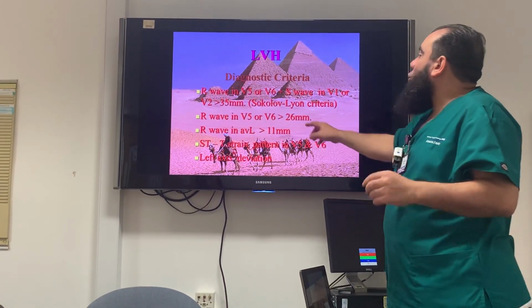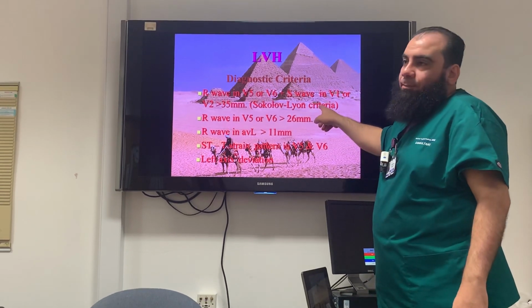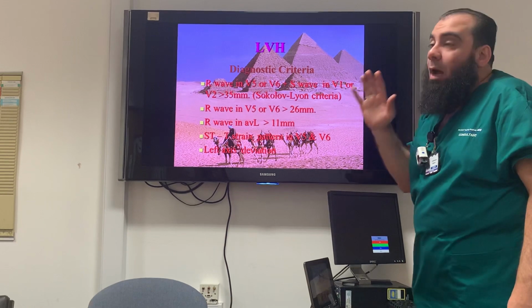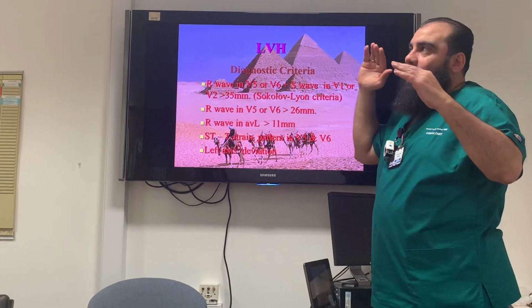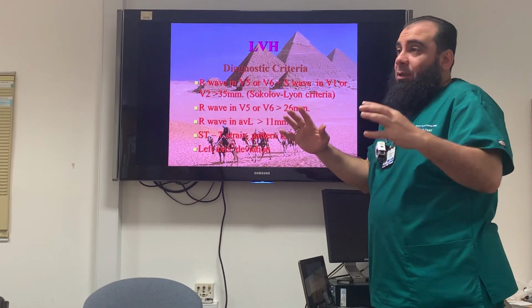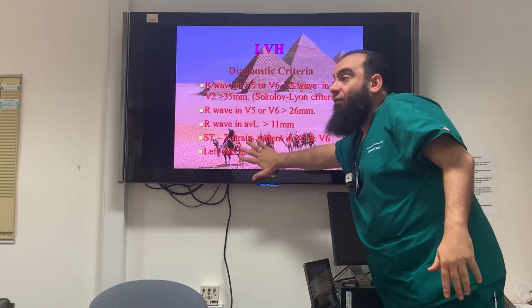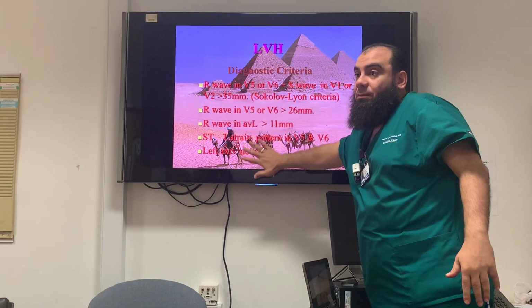Have we heard about the Sokolow-Lyon criteria? I'm going to discuss it. It is a high-level topic, so I need to tell the information about it, and for our stage, our level, it is more than 5 points.